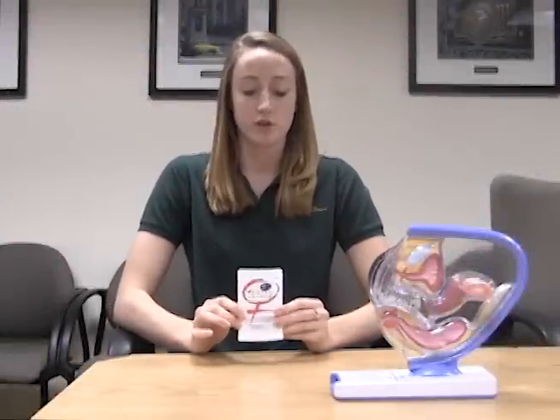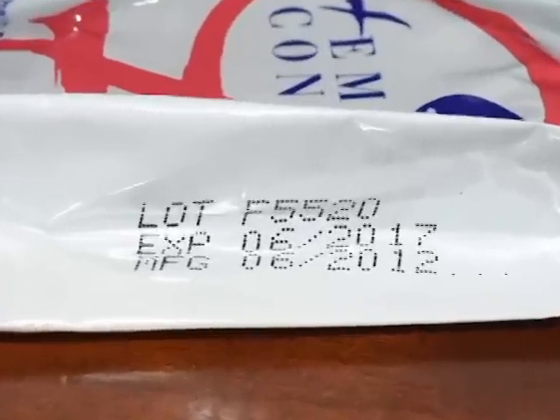This is a female condom. Before opening the female condom, you want to make sure you store it at a room temperature area. Before opening, you also want to make sure you check the expiration date and make sure it's not expired. Before you open the condom, you want to make sure the seal is not broken.